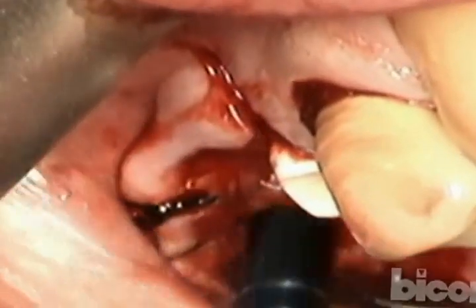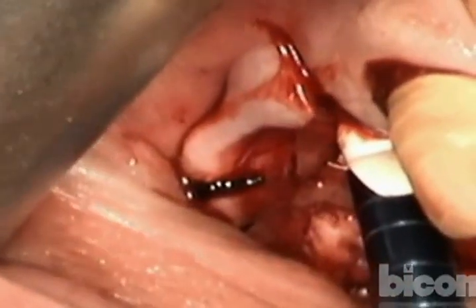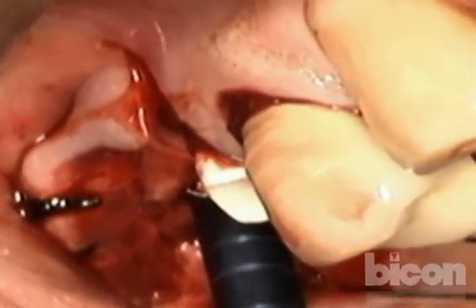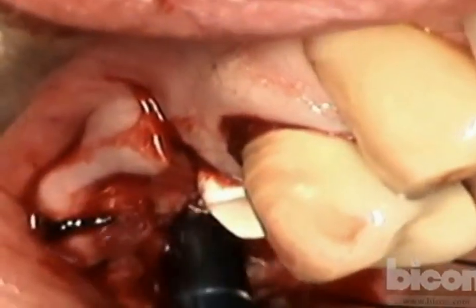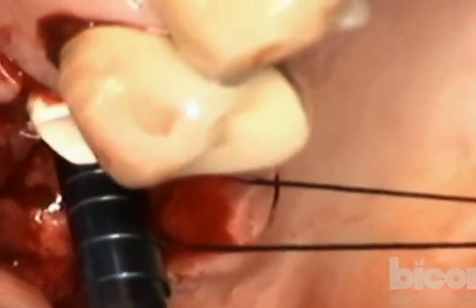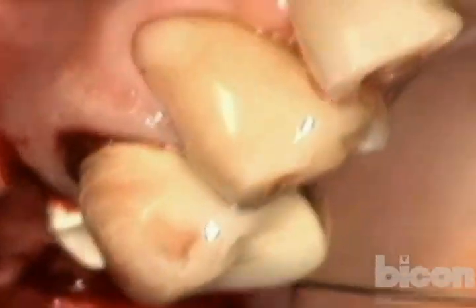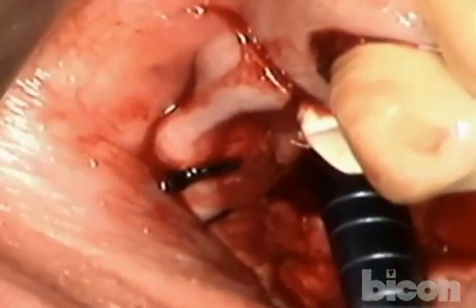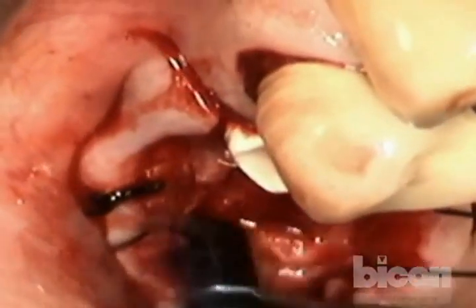Now I went to a 3.5 millimeter osteotome. Okay, we're starting to mobilize it. In a minute I will stop and give you a very good view of it. But that is really the floor transport technique in essence. Now, my osteotome is actually going into the crest. It's about 4 millimeters inside the crest, which is the thickness of the floor. But on the mesial and distal, it's a lot deeper than that. So we will keep mobilizing it until it's free of the friction of the sides.